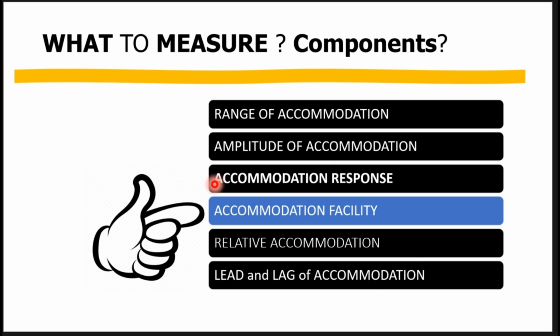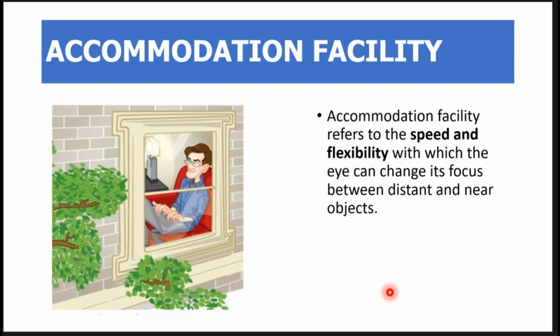So in our previous video, we talked about the accommodation response, the lead and lag of accommodation, and how to measure them using objective and subjective methods. We also went into the depths of dynamic retinoscopy. Today we'll talk about the accommodation facility. So what exactly is meant by accommodation facility?